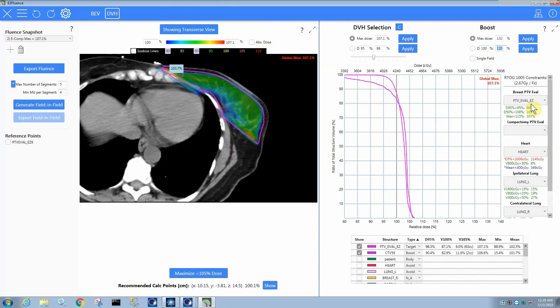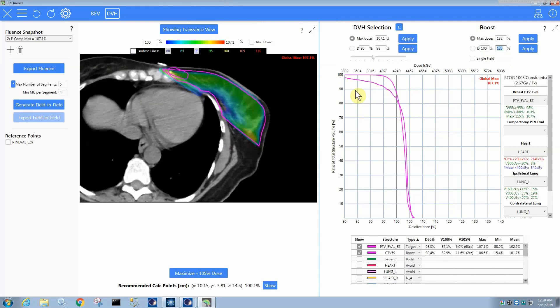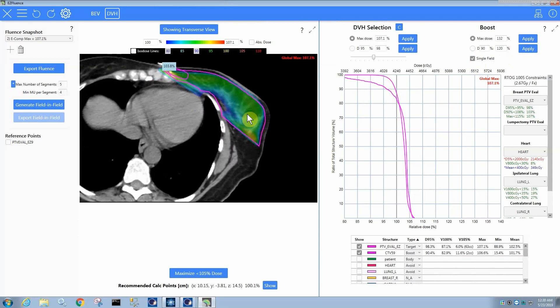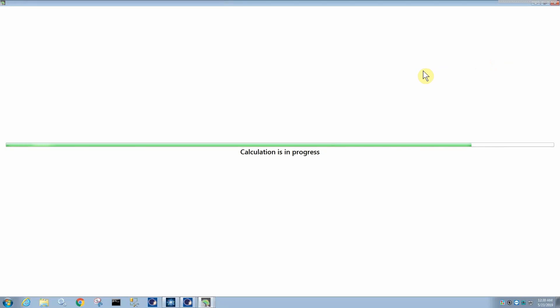But in any case, let's say we want the D90 on this structure to be 120%. So we can type those values in. You can say you want to do a single field, which means it's going to try to figure out which field delivers the most dose to this structure and only boost that field. So I'm going to come in and press apply here.